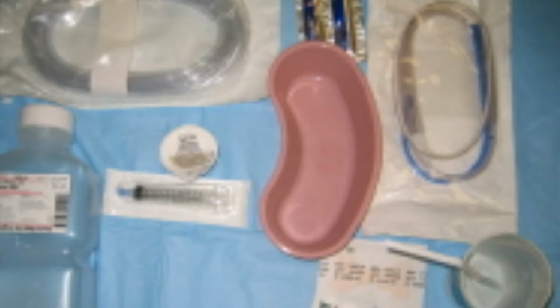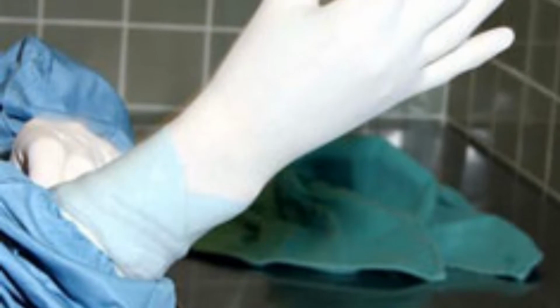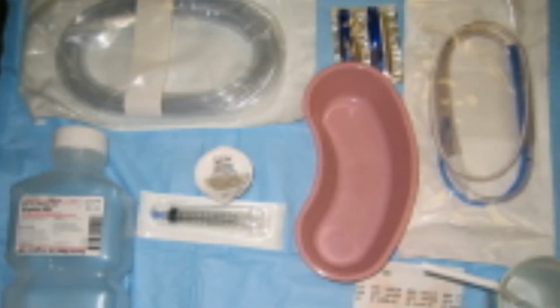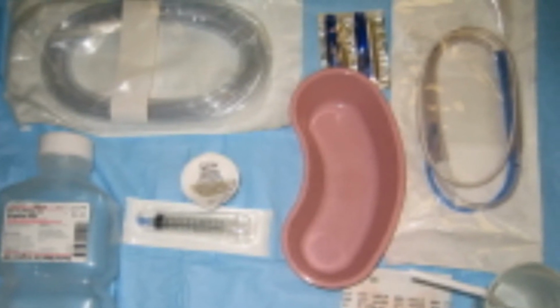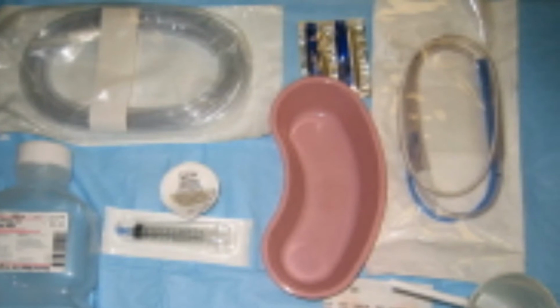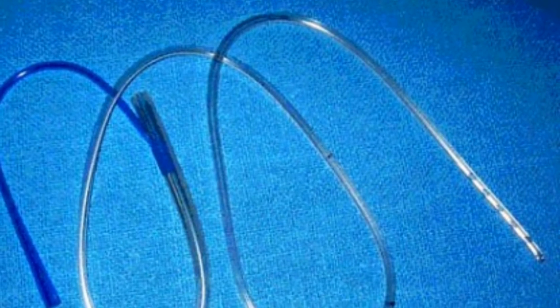Before beginning your procedure, be sure to verify that you have all of the necessary materials, including non-sterile procedure gloves, goggles, and gown, portable or wall suction equipment, hypoallergenic tape, an occlusive seal dressing, or a pre-manufactured NG tube holder, an emesis basin, a cup of water and straw, your stethoscope, a 20 to 60 milliliter irrigation syringe with an irrigation tip, 100 milliliters of water for irrigation, towels to protect the patient, and the appropriate size and type of NG tube. And now we're ready to get started.